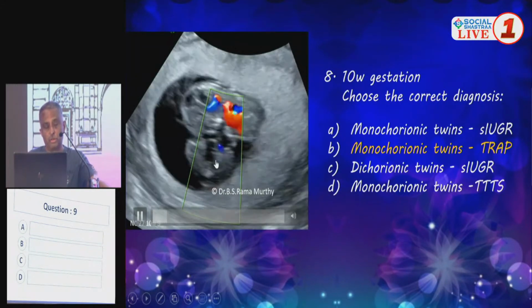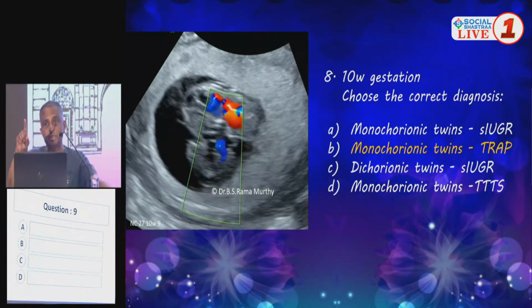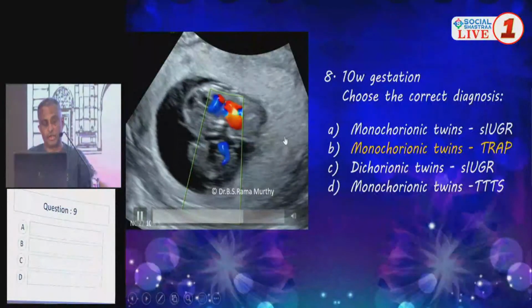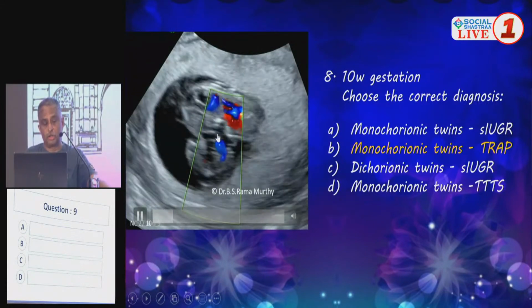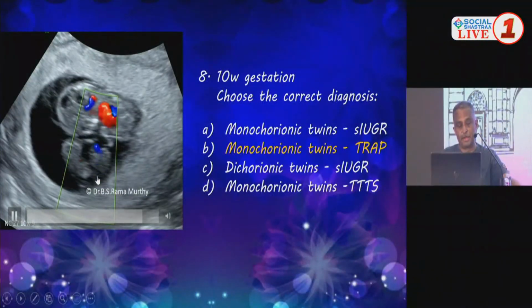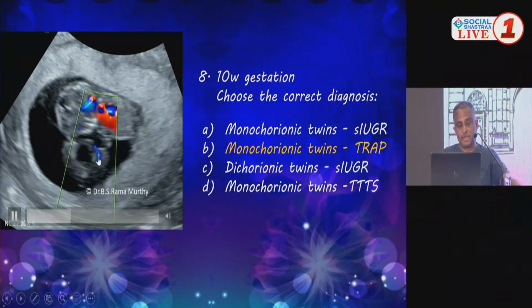Remember, both these fetuses have the same gestational age or different? Same gestational age, because it is monochorionic, and monochorionic means monozygotic. So both of them came from the same zygote which split. Therefore, both of them should have had this kind of configuration. Instead, you have an amorphous bit there, but what should catch your eye is the umbilical cord insertion of this bit. Now, this is pulsatile.